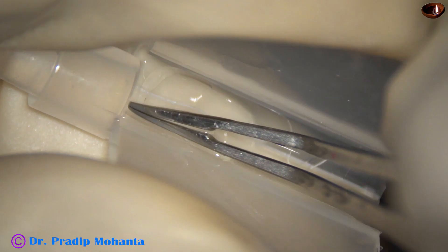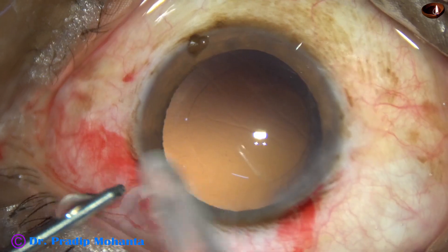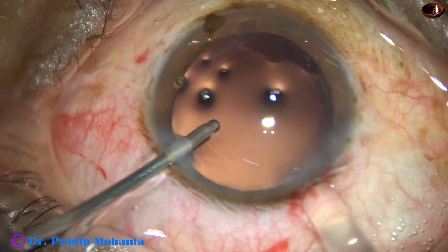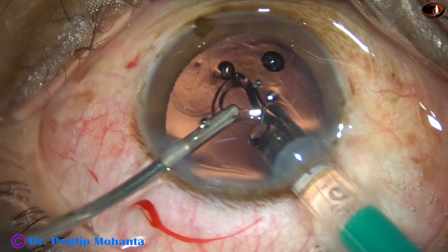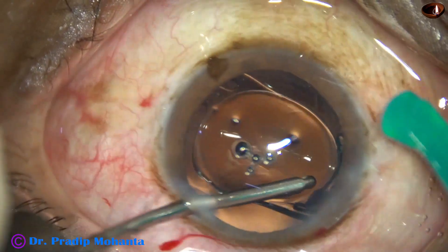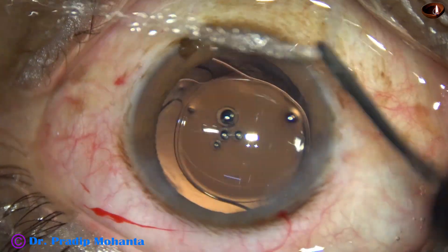This is a hydrophilic acrylic single-piece monofocal intraocular lens. This is hydro-implantation of the intraocular lens. The lens goes into the capsular bag just by a push of the left-hand instrument — in this case, the irrigating cannula.